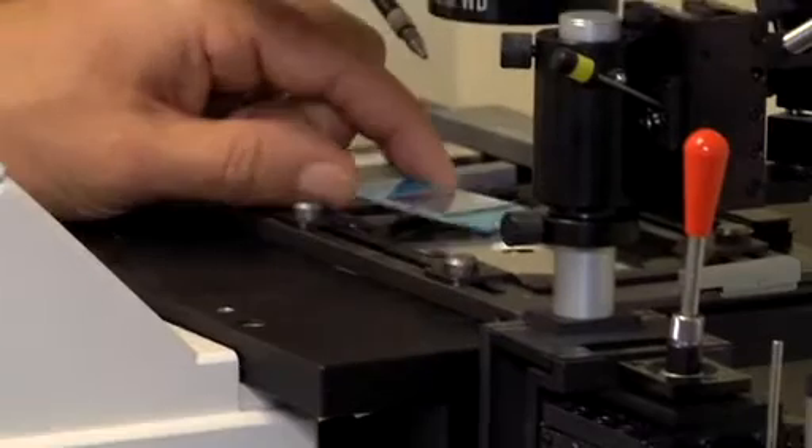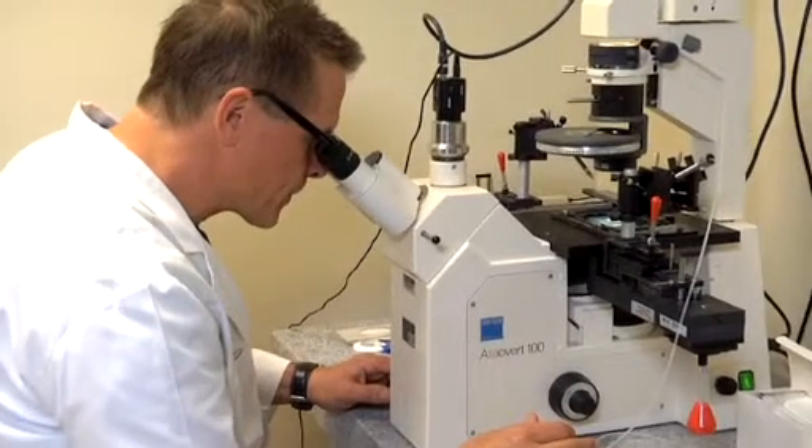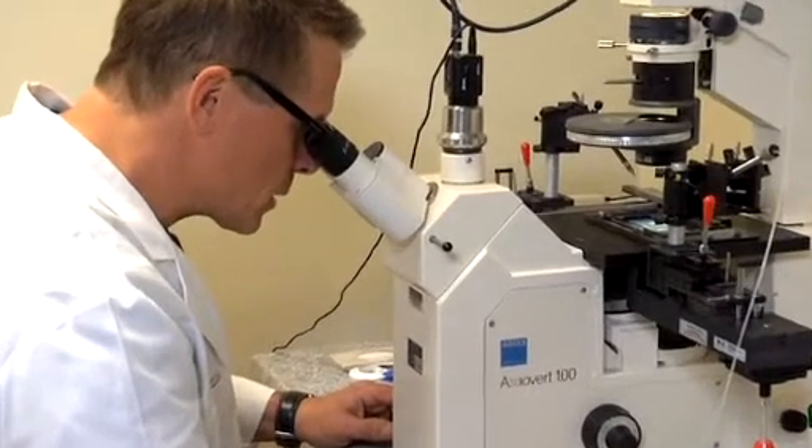It does not require a general anesthetic, and what it allows us to do after numbing up the area is to take very, very tiny specimens of tissue that we put on a slide, plate out, and then send off to cytopathologists to read out these specimens.